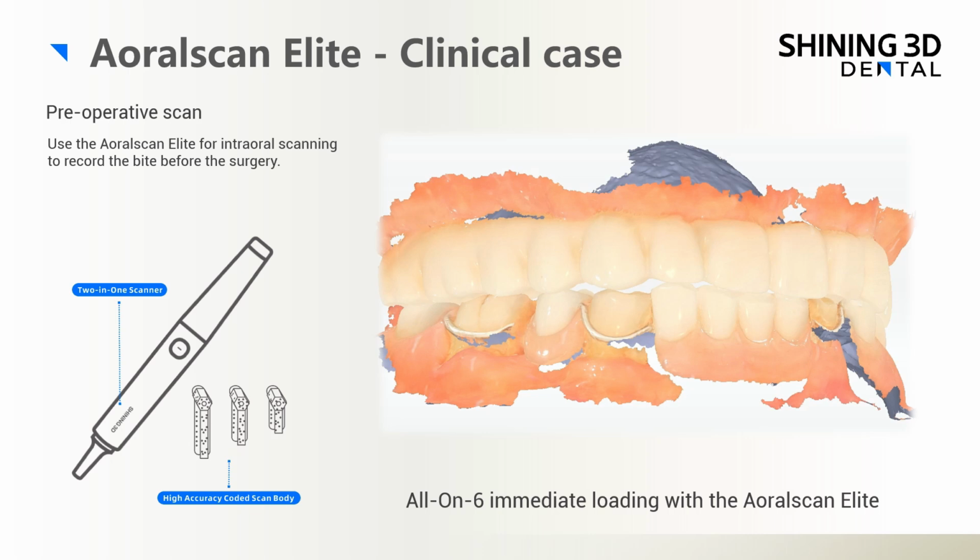First, we performed a pre-operative scan using Elite to capture the patient's pre-operative occlusal data, which was later transferred to the provisional tooth design. Aoralscan Elite is not only suitable for full arch fixed implantation restoration cases, but also highly accurate and efficient for common regular cases, including restorations, implants, orthodontics, and edentulous cases.